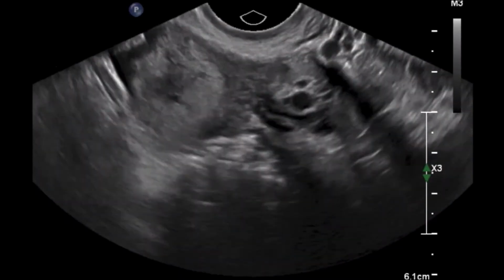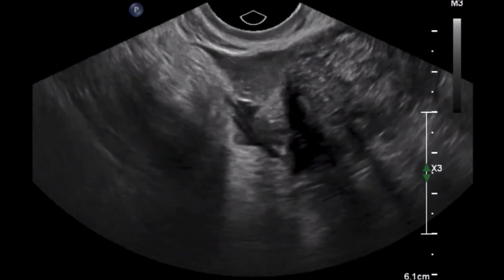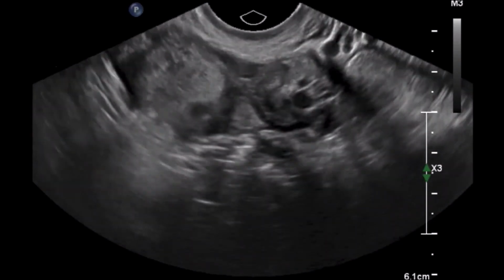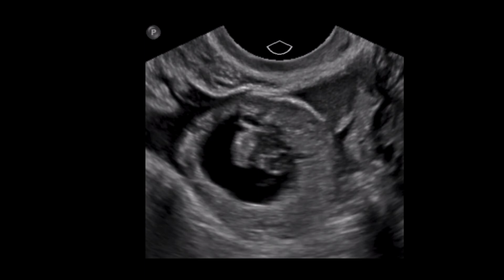After imaging the uterus, the adnexa were further evaluated. In this short video, the operator fans lateral to medial, starting at the tubular appearing iliac vessels, which are often considered the lateral border of pelvic ultrasound. As the operator fans medial, a distinct abnormal adnexal structure with a gestational sac and fetal pole is identified. Here's a still shot showing this abnormal adnexal structure, which more clearly shows the gestational sac and fetal pole. While not shown, a heart flicker was identified. These findings confirm the diagnosis of an ectopic pregnancy.